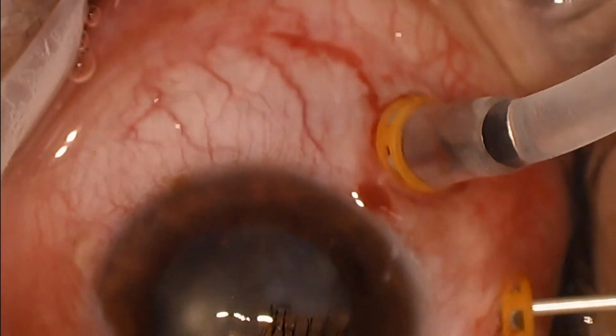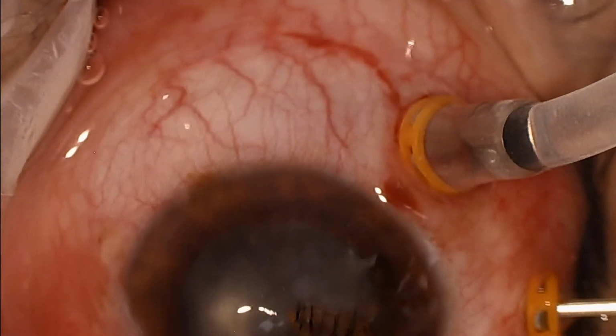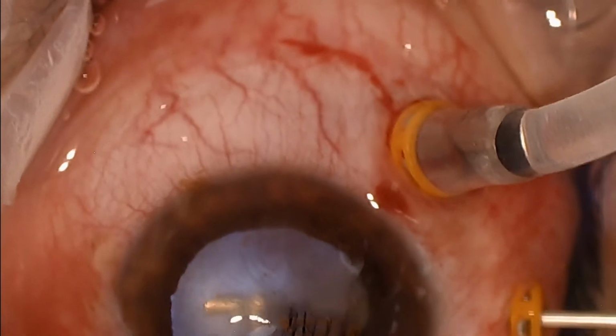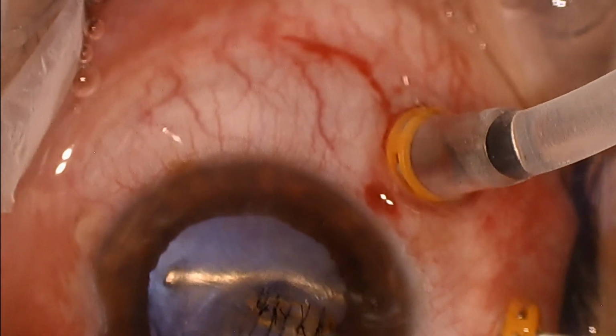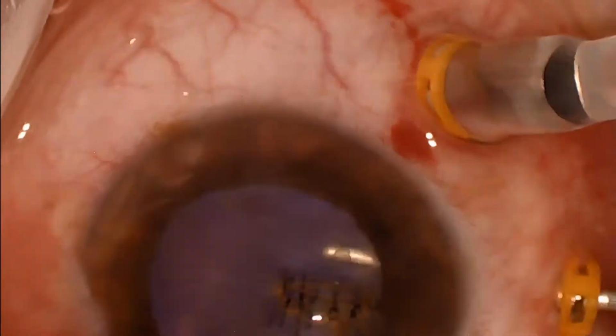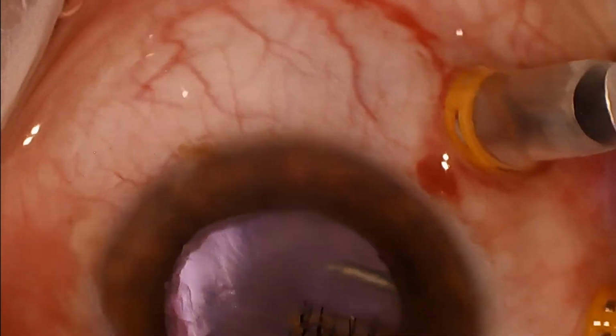Now we're going to start with the vitrectomy aspect of the procedure, and I'm going to do a lensectomy. And this is a young patient, so I'm just going to use the vitrector to remove all of the lens material here. And the nail definitely penetrated through the lens. That's how we're having the expression of the vitreous all the way through the lens.